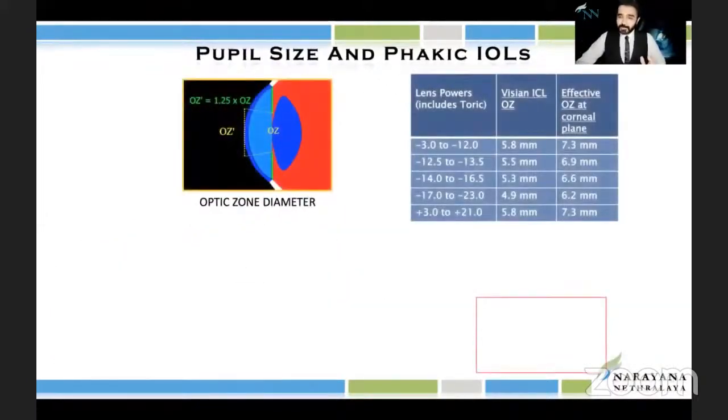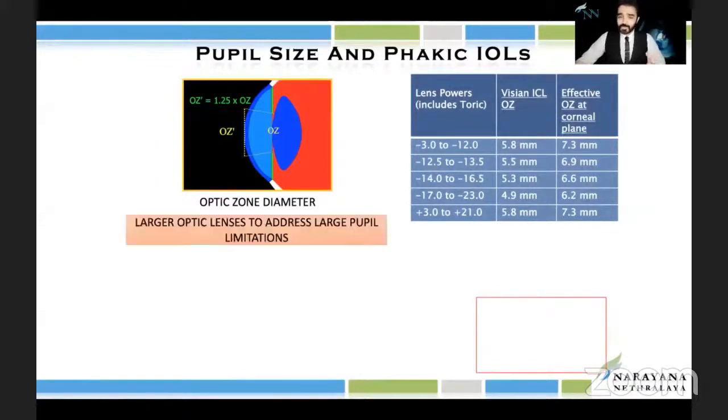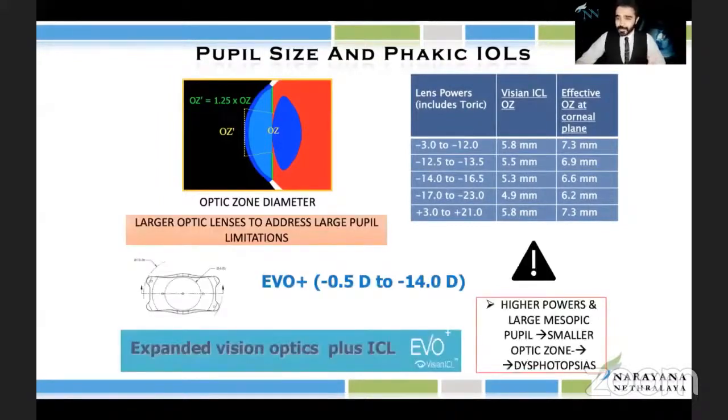Now, you have to keep in mind also, depending on the power of the IOL which is being implanted, the size of the lens and the size of the optic can change. So keep that in mind and then plan for the surgery.